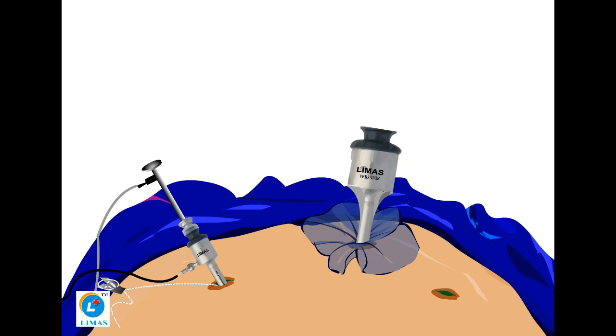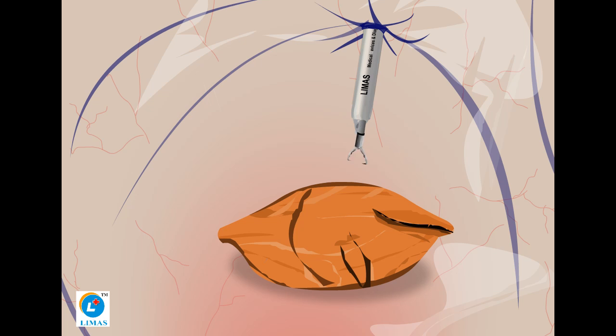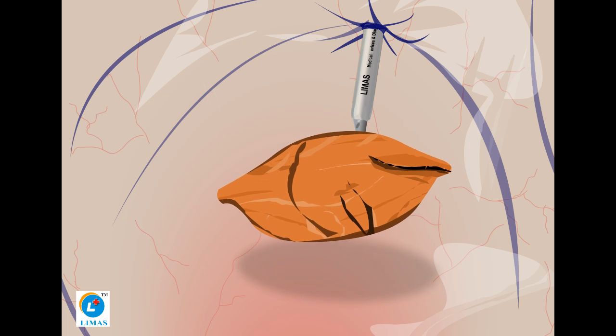Introduce the Lemus Tissue Morcellator through the mouth opening and perform morcellation by keeping the Safety Isolation Bag inflated throughout the procedure.